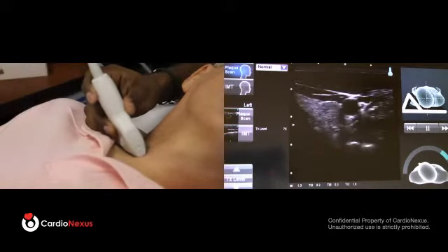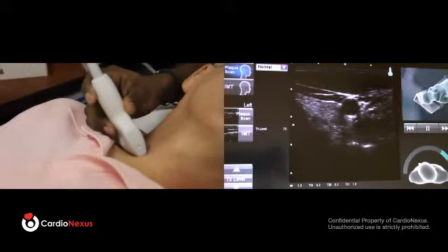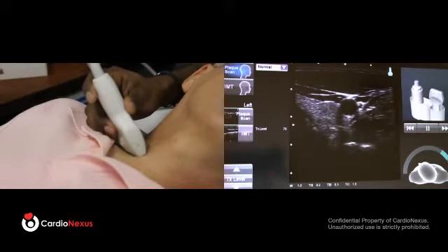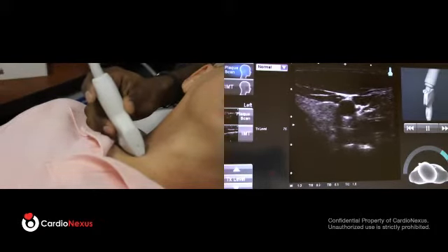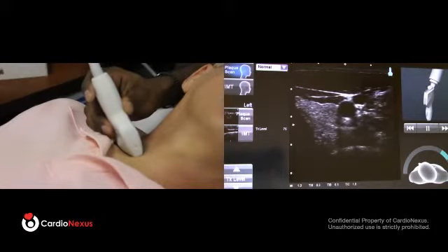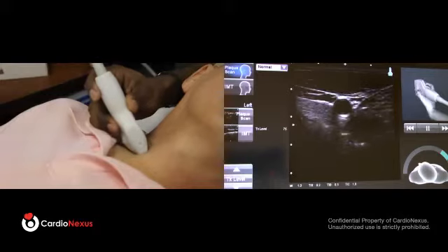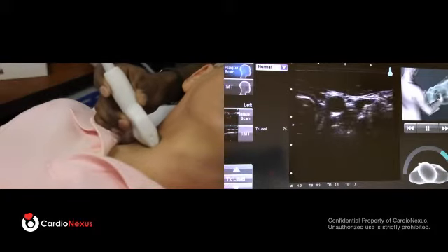You'll locate one dark pulsating circle, and that is the carotid artery. It's always easiest to start low on the neck, because you have a lot of brighter, echogenic tissue. Slowly start sweeping the probe up, pulling it toward his jaw.